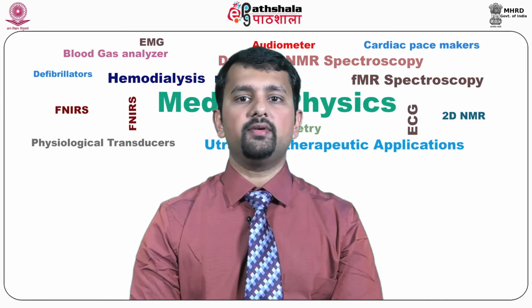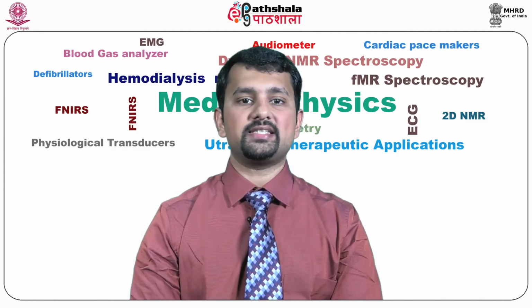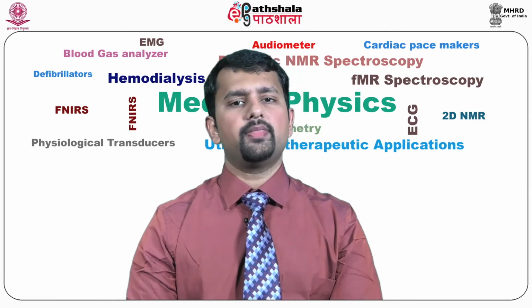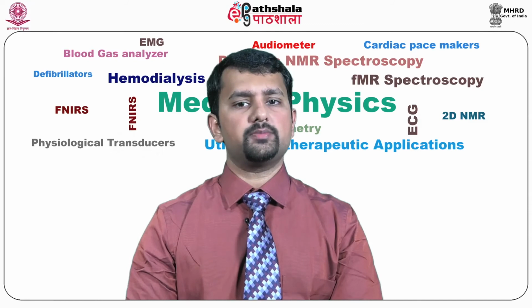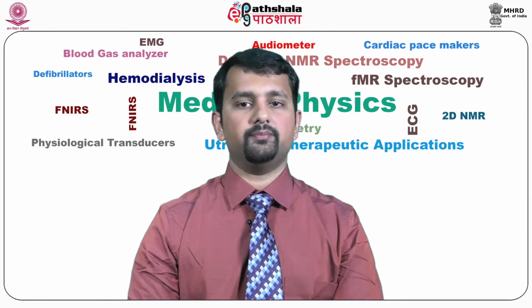The use of liver MR spectroscopy for focal liver lesions is a challenge due to motion related artifacts and voxel size localization to small regions of interest. The principal metabolite that has been targeted in focal liver disease is choline.